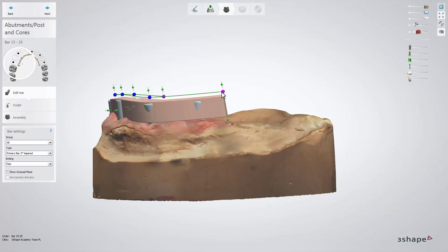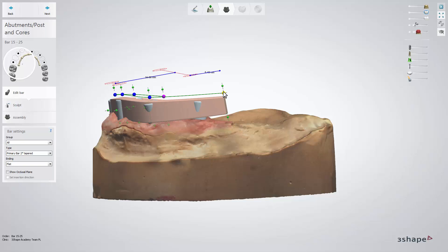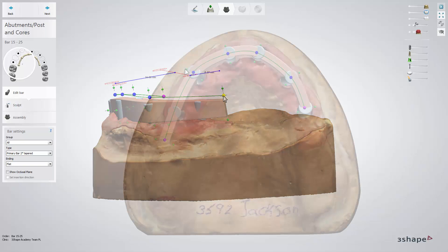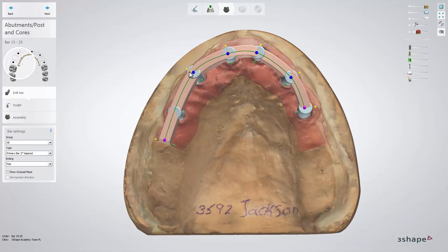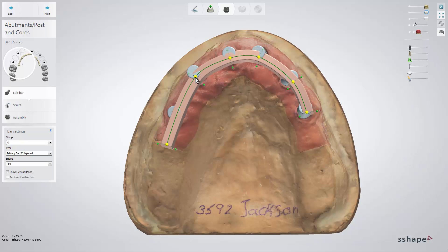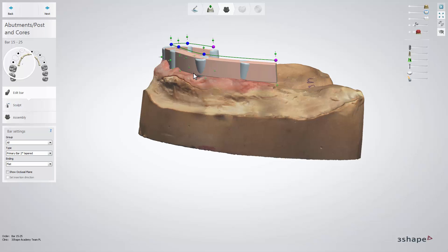You can also adjust the bar width, angulation, and height. The blue and purple control points allow you to do this in multiple directions, whereas the green ones only in directions shown by vectors. If you press Shift and click a control point, you will be able to move all points in a given direction.